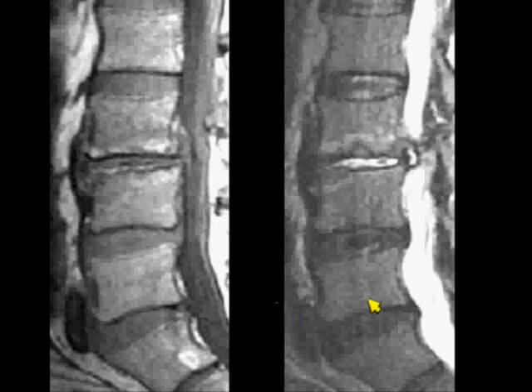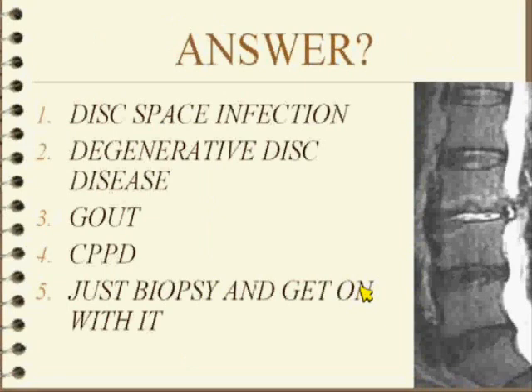We're running down the rabbit hole of infection. You're faced with this case: T1 on the left, T2 on the right. What are you going to do with this lesion? Is this a disc space infection? Is this degenerative disc disease? Is this gout? Is it CPPD, or just biopsy it?